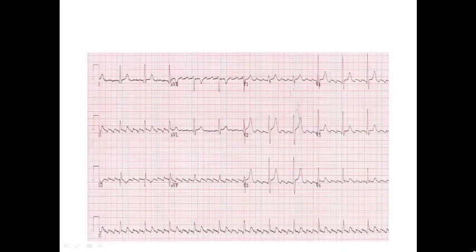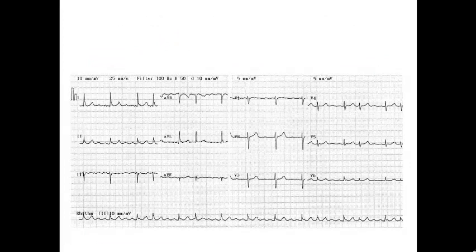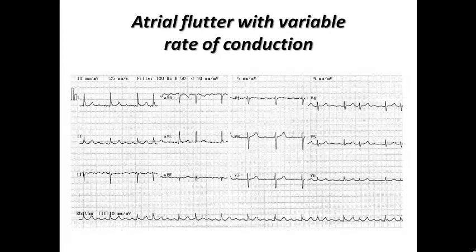In another ECG example, there are approximately 4 flutter waves between each two complexes — atrial flutter with 4:1 conduction. The flutter waves are negative in inferior leads and positive in V1, confirming typical counterclockwise atrial flutter with 4:1 AV conduction. There is also a pattern with irregular rhythm but flutter waves of fixed morphology between complexes, representing atrial flutter with variable rate of conduction — reminding us that irregular narrow complex tachycardia can be atrial fibrillation or atrial flutter with variable conduction.